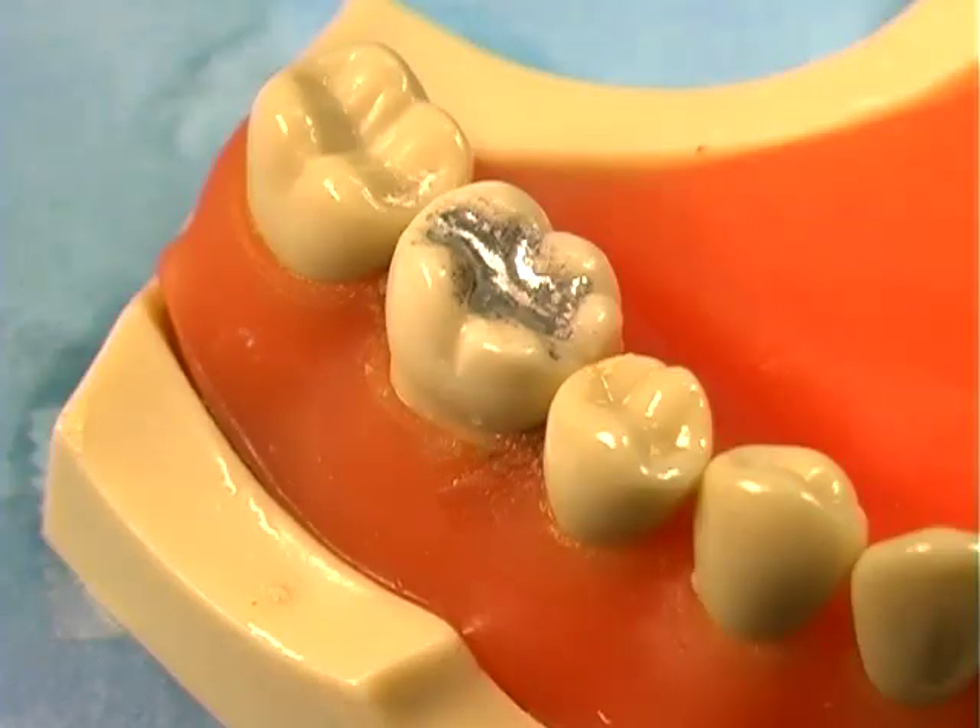The amalgam surface should be smooth, free of defects, and have a shiny appearance. There should be no voids or dull areas.